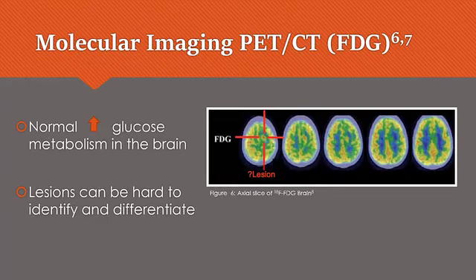Molecular imaging with PET-CT has been viewed as a prevailing complementary tool for brain tumour imaging. Fluorine 18 fluorodeoxyglucose is the most commonly used PET radiopharmaceutical in oncology. However, because of the brain's high glucose metabolism, differentiation of physiological processes from malignancy can be problematic.